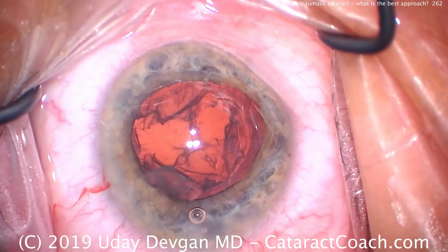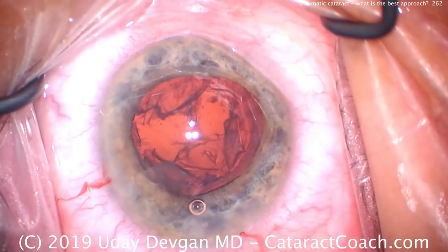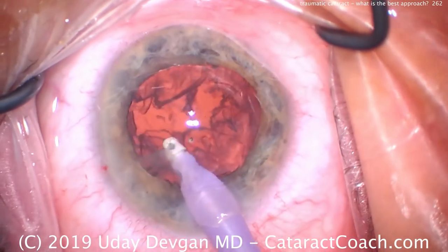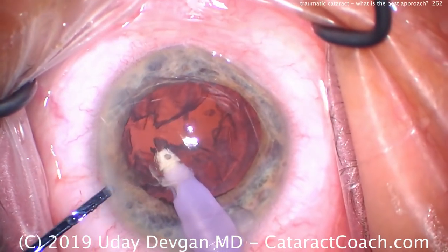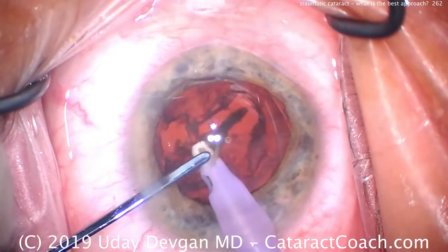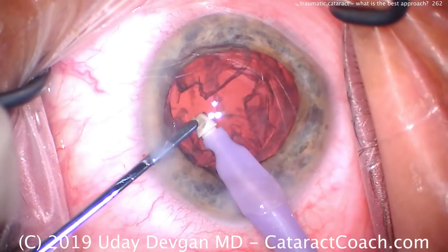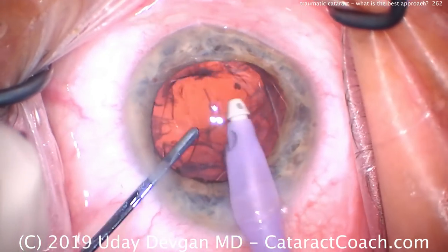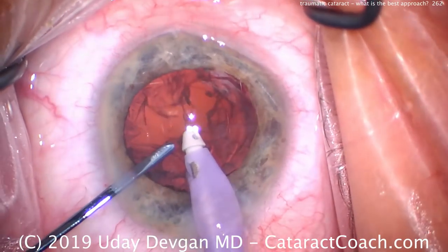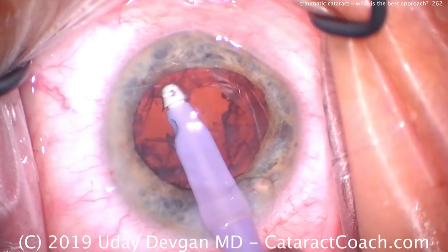Just wiping away a little mucus with a sponge. And now let's do the cortex removal. Here we have to be very gentle. So let's take out this little nuclear piece here or epinuclear shell. We'll wolf that down. So remember the beginning of the case where the area of the traumatic cataract was. So as we remove the lens cortex, we could do that area, but nah, let's do away from that area first. Let's go over here instead.